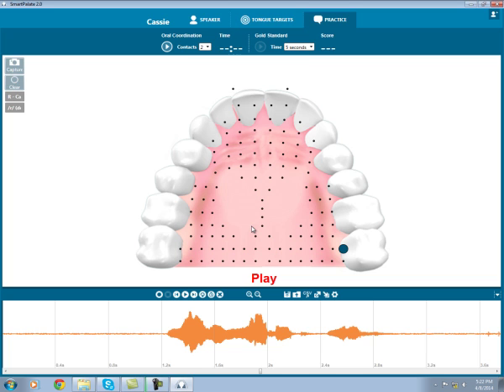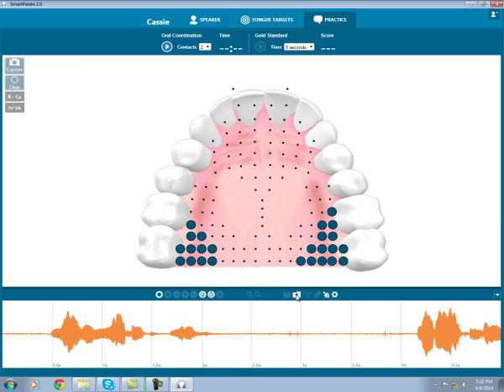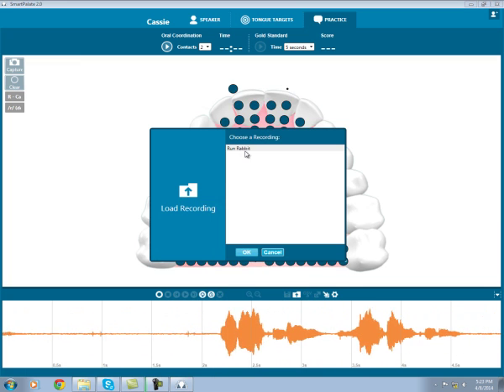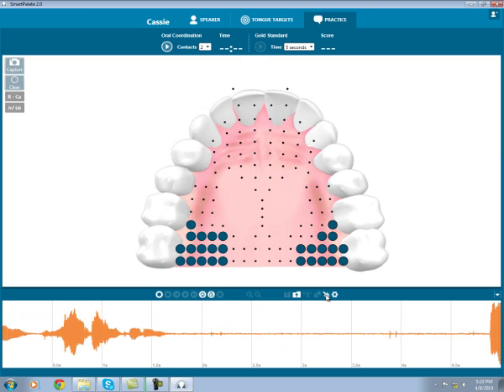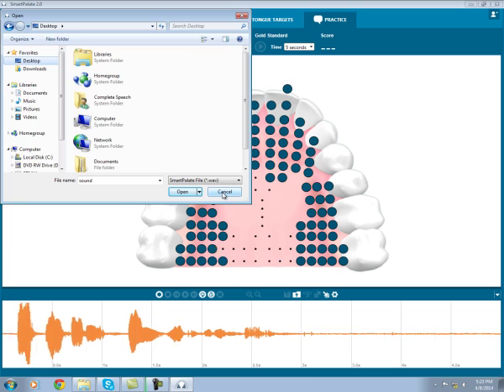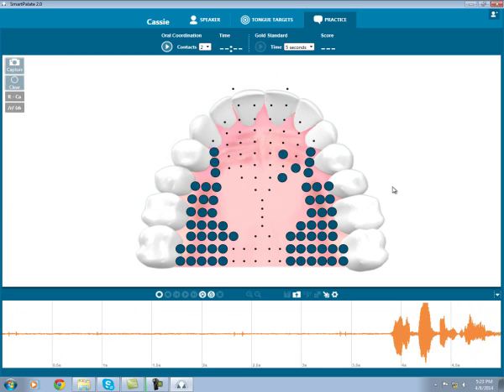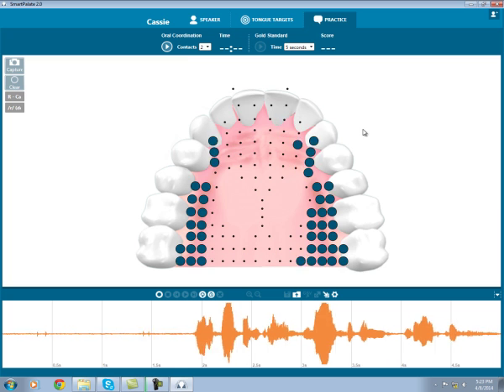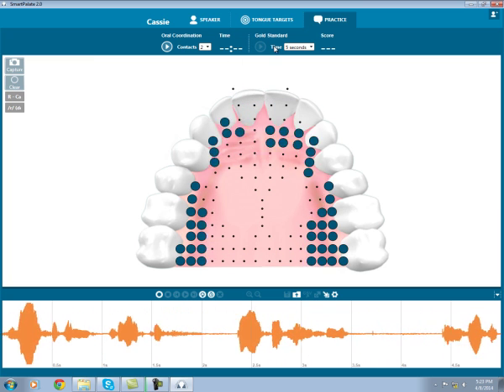Once I am done with the recording, I click this X to clear it out. Later, I can go and load that recording or import it from my computer's files. In the practice tab, you will also find two activities: oral coordination and gold standard.